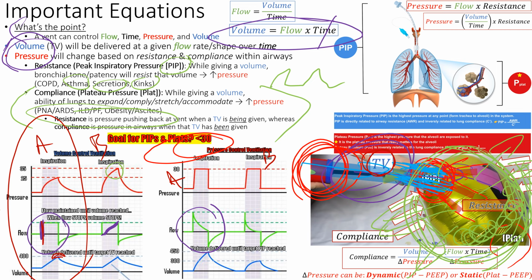But now we have smarter modes that will adjust the volume with every breath. It has a little flow chart inside of it, a little algorithm inside of it. We'll say, I accept your 400, but I'm going to give 300, and we're going to see how it works. And if I have a lot of room, I'm going to maybe go to 450, right? It's going to, every breath, adjust the tidal volumes.